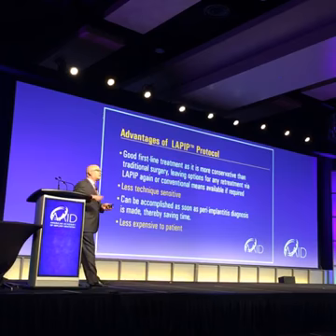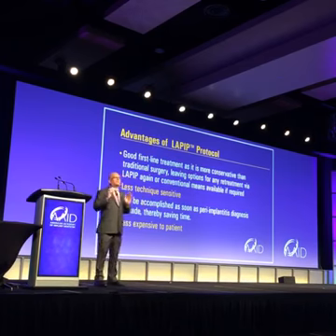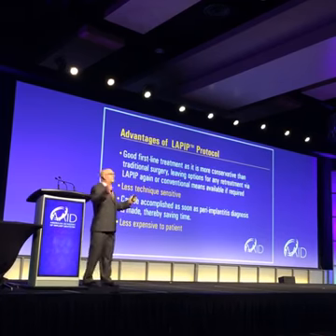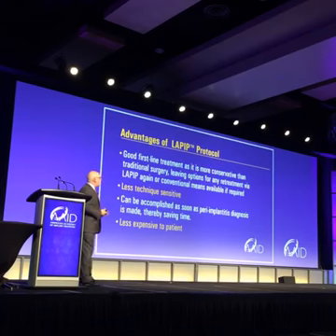So what are the advantages of the LAPIP protocol? It's a great first-line treatment. As soon as you see the infection, you can get started on this patient right away. You don't have to wait. You don't have to scale and root plane for a month. You don't have to make sure you have $5,000 worth of biomaterials waiting to be used.